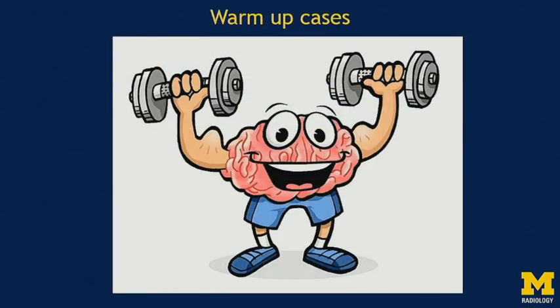So in the beginning, I'm going to show you 3 case-based slides. Do not use your audience response questions for these 3. We will revisit them later again in the lecture, but it will give you a sense of what to expect in the lecture and also be a kind of self-assessment.